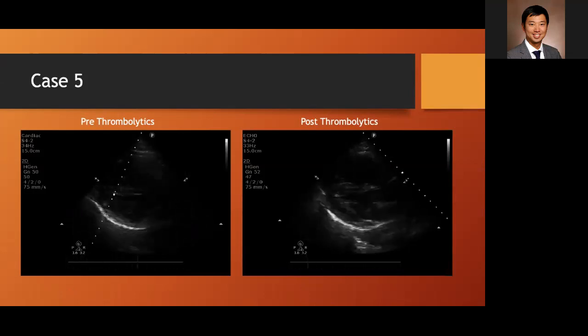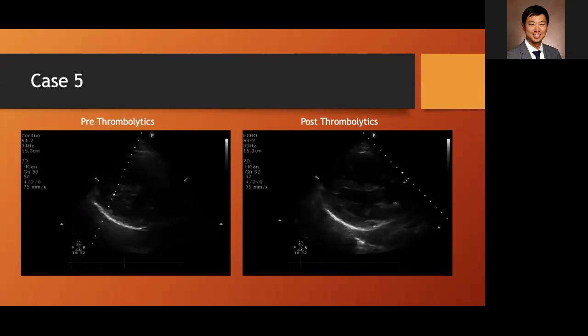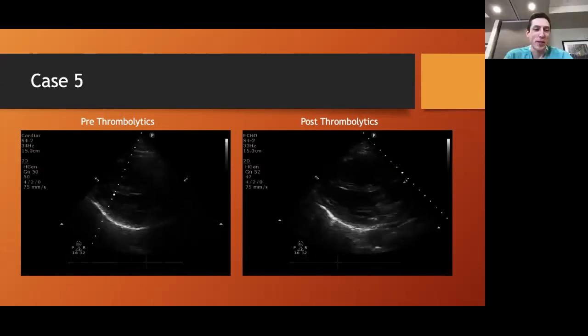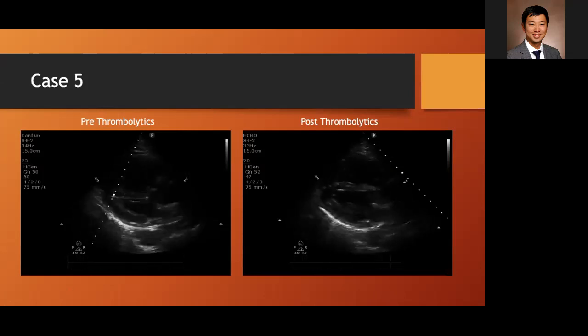The other option is these EKOS catheters that we have also. The one interesting thing about the EKOS catheter, I don't know if you've ever done an echo while on an EKOS catheter, but it's a catheter that's left in place with kind of a tPA at the tip so that it causes the clot lysis, but also ultrasound waves to kind of shake up the clot. So it actually causes a massive artifact on your ultrasound image whenever you have an EKOS catheter. Well, that's unfortunate. Another reason to dislike EKOS catheters. Yeah, you can pause them for a minute though.